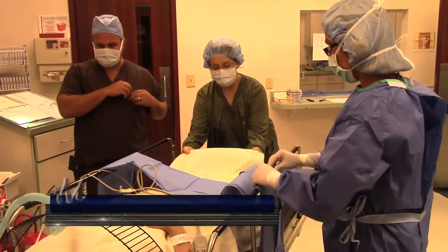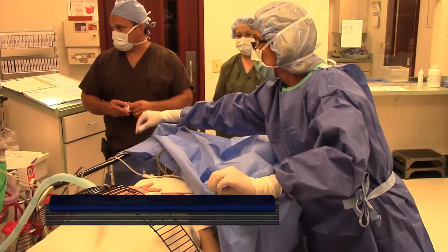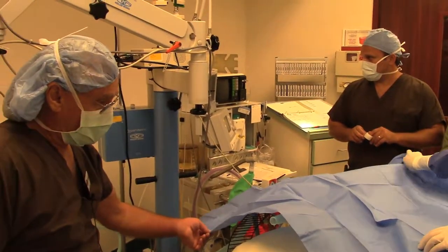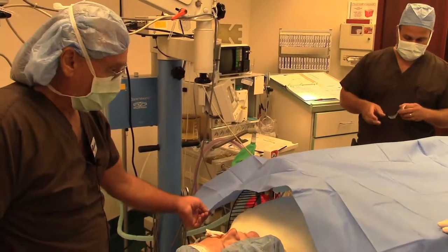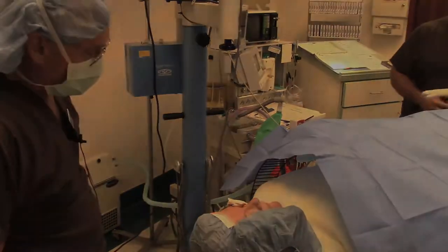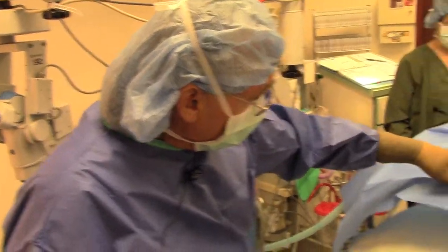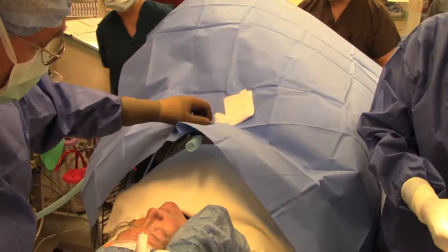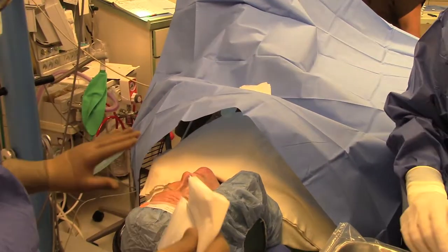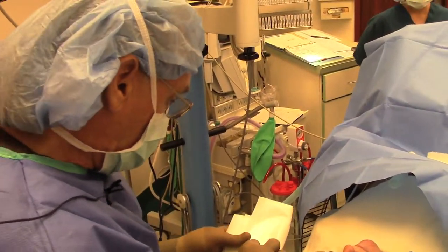Now we're putting on the bed drape, which does not come over the patient's face but up over the device that keeps it off the patient. And then we'll put our plastic drape on here in just a minute. Now, as you'll see, there's a little device right there with great airflow coming out of there. As you put the plastic drape over the patient's face, they're going to have a nice positive airflow underneath the drape.